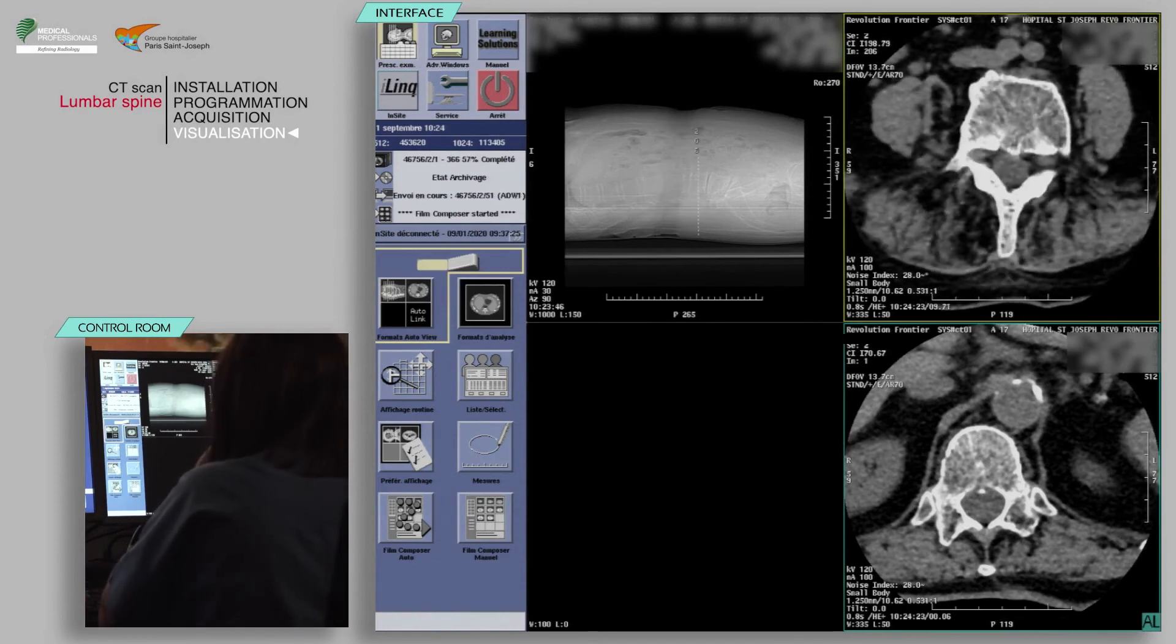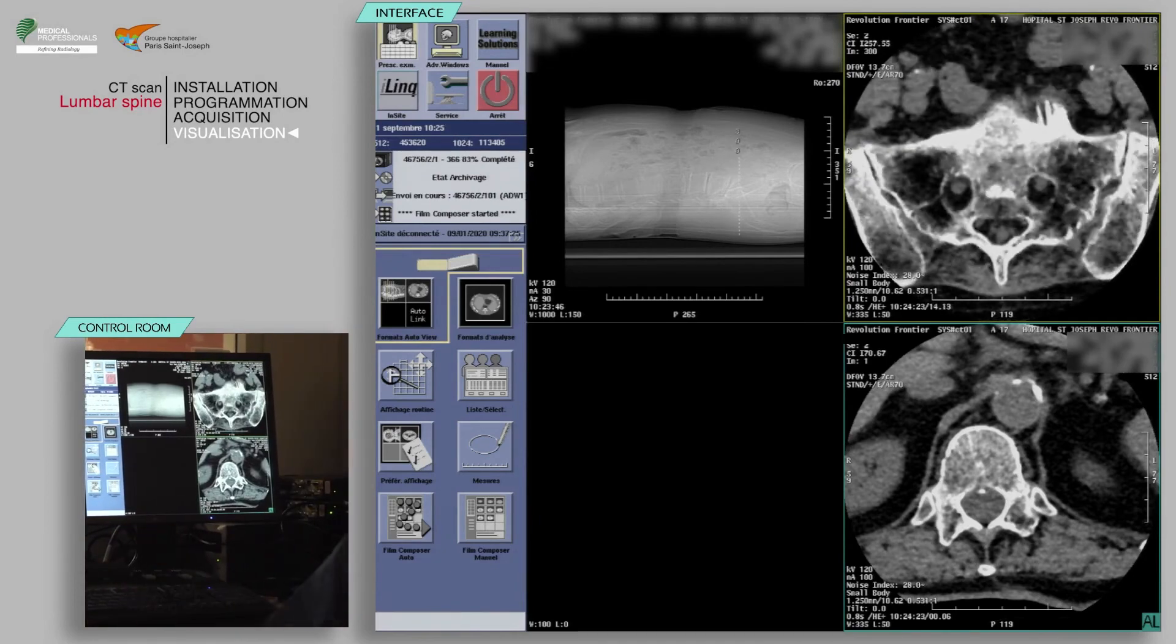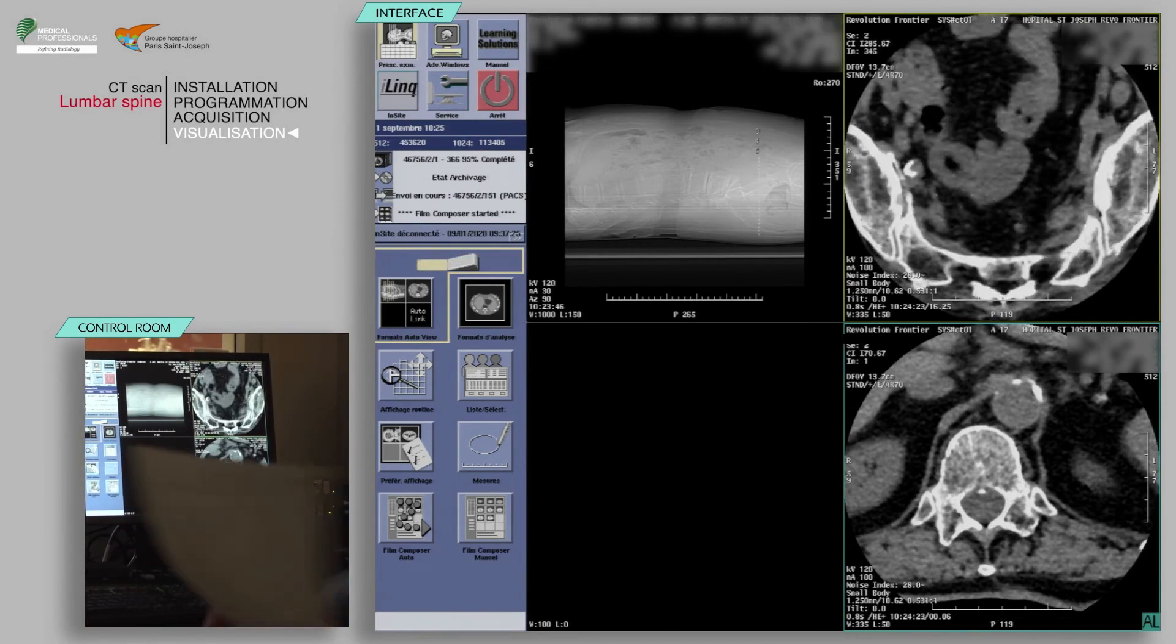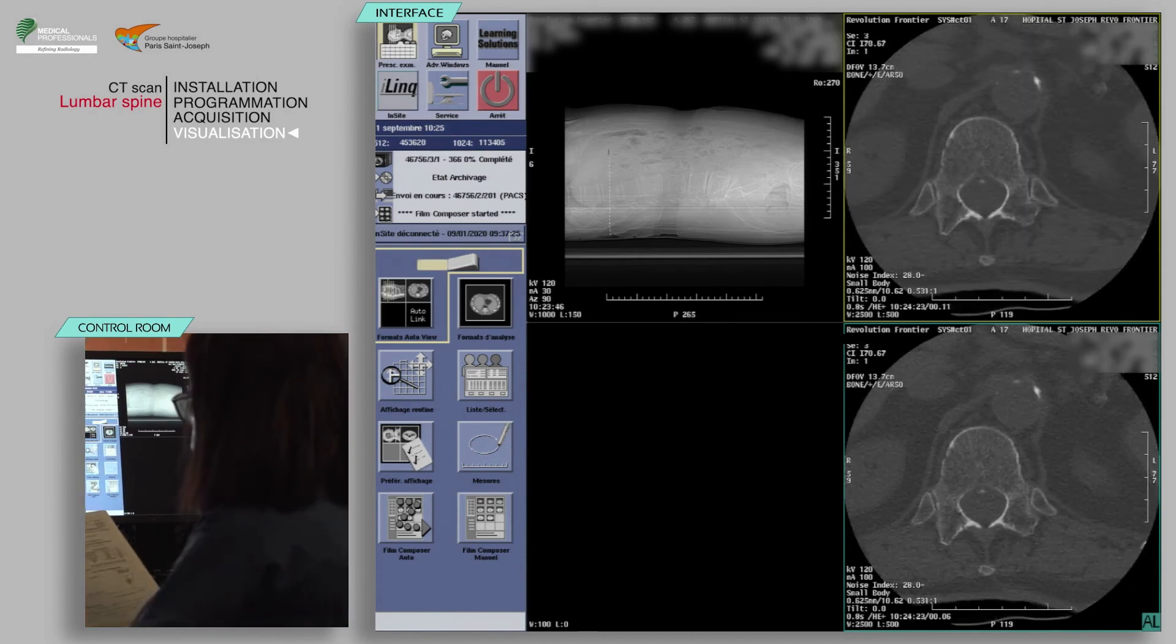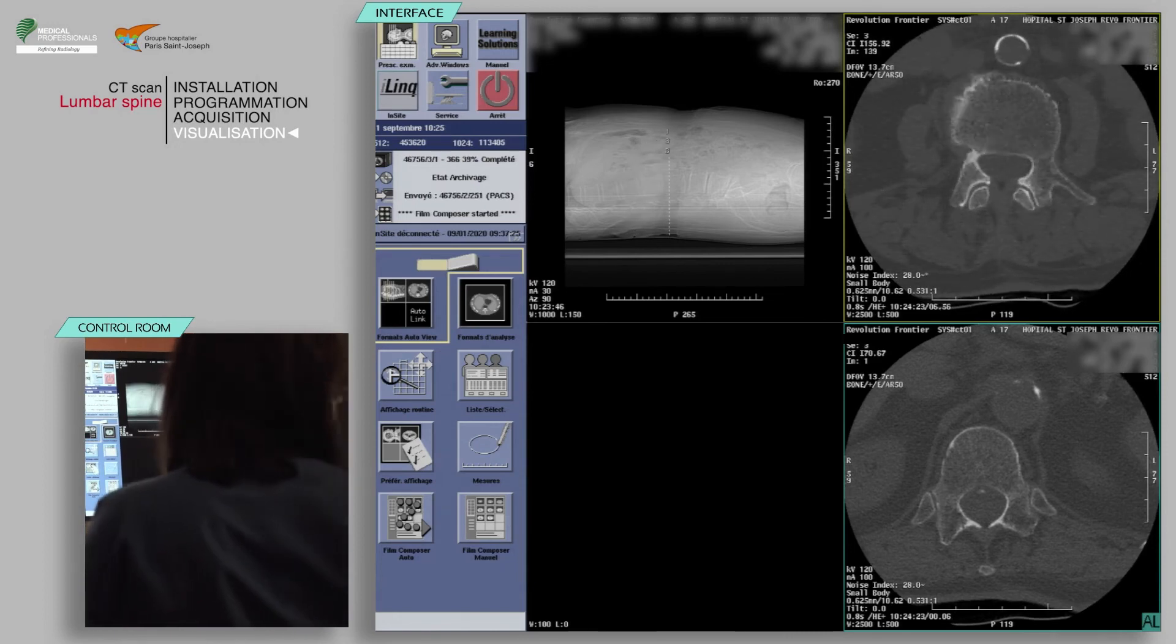The visualization of the spine in the sagittal and coronal plane is essential in case of spinal trauma. A set of axial reconstructions, each in the plane of the disc spaces, is appreciated for a study of disc spaces and spinal nerve roots.